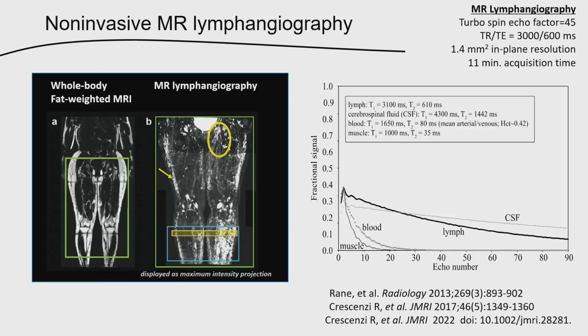So that's the fat-to-water ratio. And in third, we look at a vascular imaging method that we're interested in, how this relates to sodium and fat deposition in the legs. This technique has been called MR lymphangiography, and we provide it in a non-invasive way. It is really heavily T2 weighted and sensitive to slow-moving fluid in the tissue.